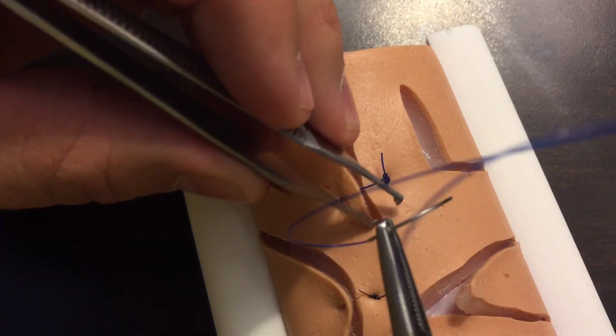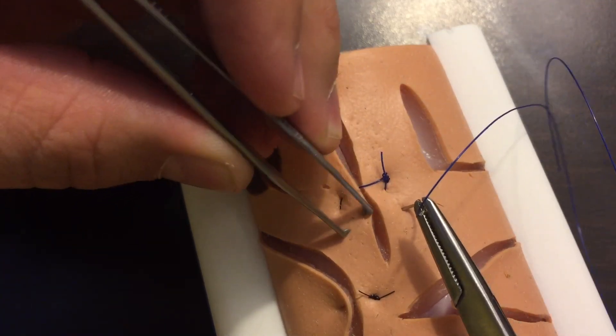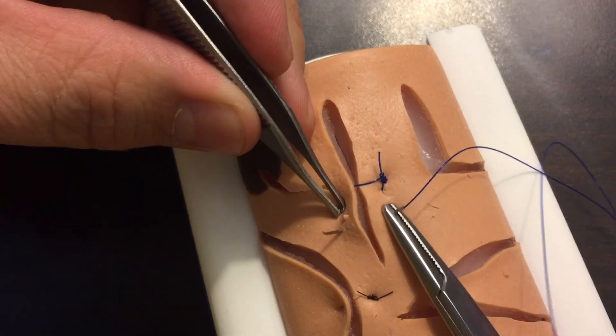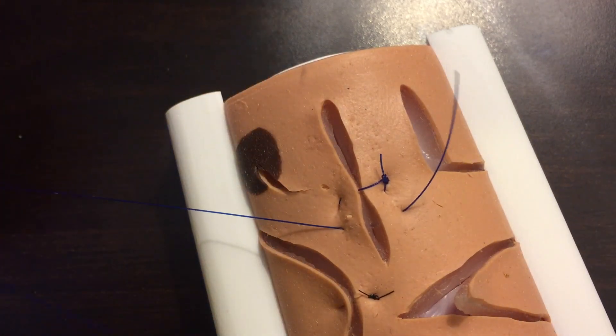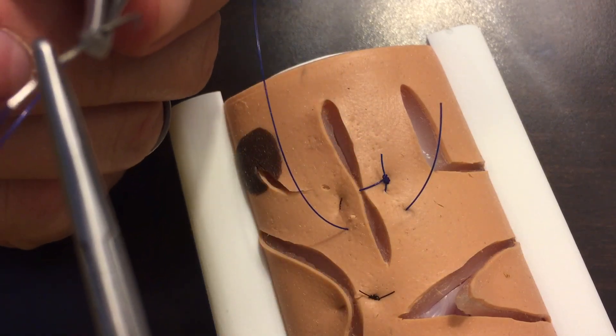I'll demonstrate again here. Entering at 90 degrees, coming across and exiting here. Then we're going to load our needle again backhanded.